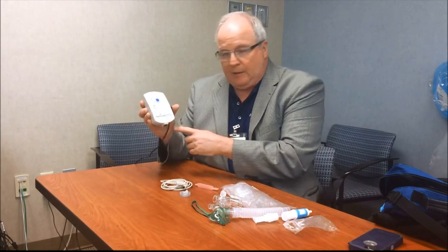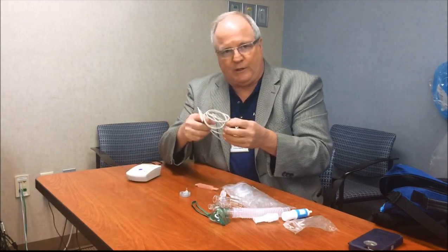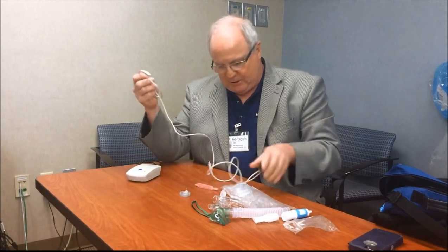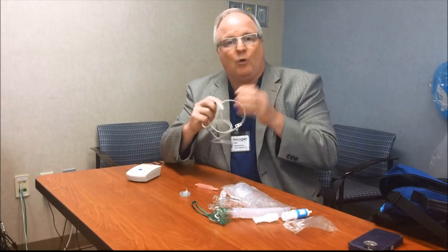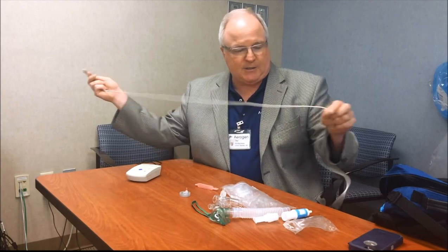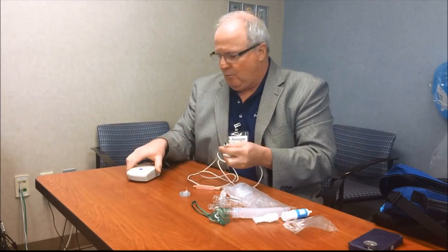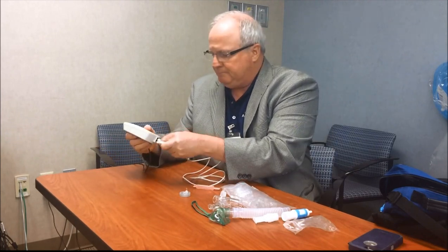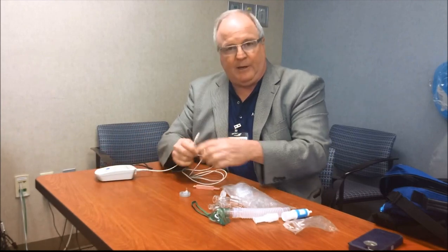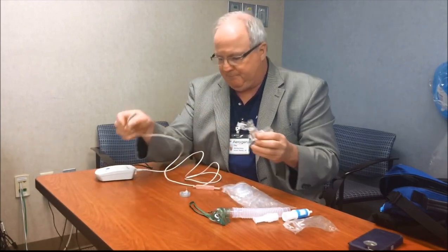In addition to the AC adapter and the controller, we also have what's called the controller cable. This is the cable that actually goes between the controller module and the Solo nebulizer, which is the device you're going to actually use to nebulize your medication. So there's two ends, obviously. One is a circular end, and it's going to plug in right here at the bottom of the controller. And the other end is going to plug into the Solo, which I'll explain to you here shortly.